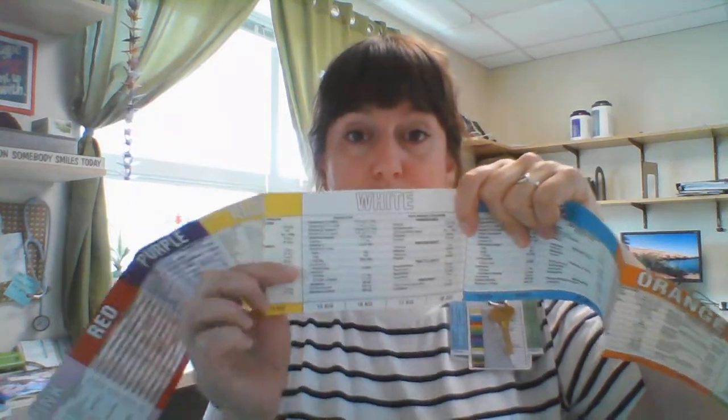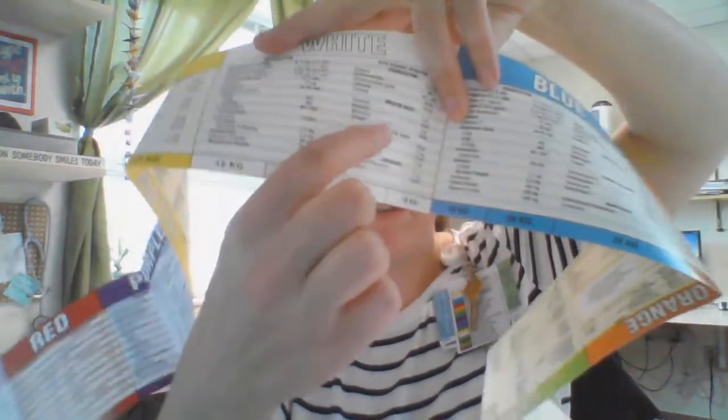The red arrow goes to the top of the head, you expand the tape, and lay it next to the patient. Wherever their heels fall tells you their weight. For example, if the heels fall here, that's 17 kilos. The Braslow tape has different colors corresponding to different weight ranges, and it tells you equipment sizes and medication doses appropriate for a child that size — keep it out during the entire resuscitation.